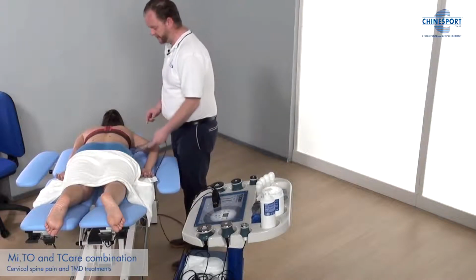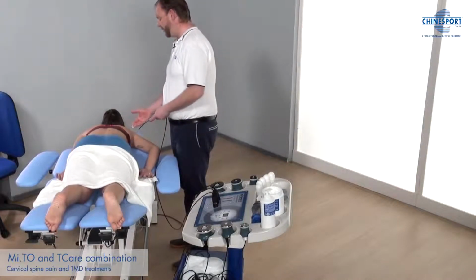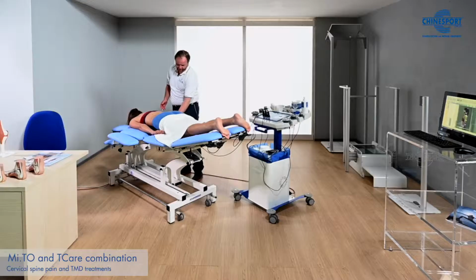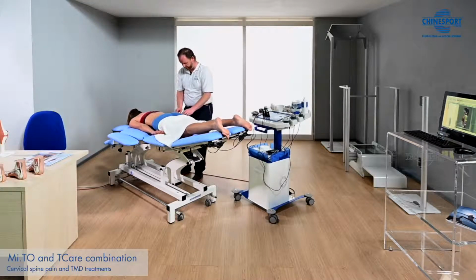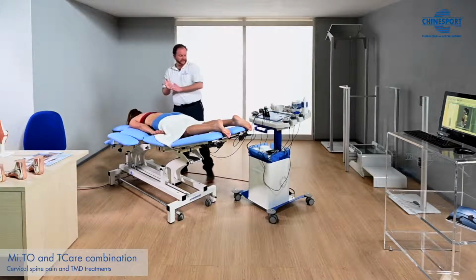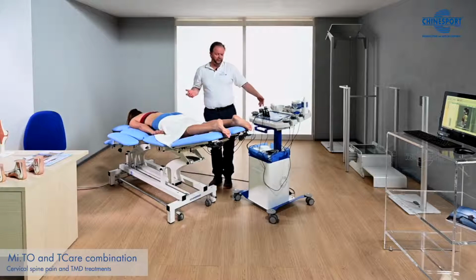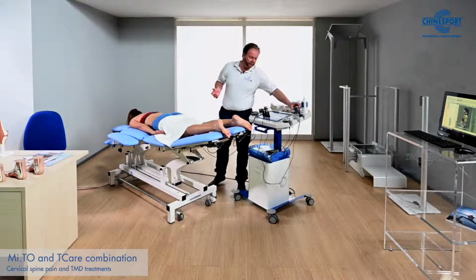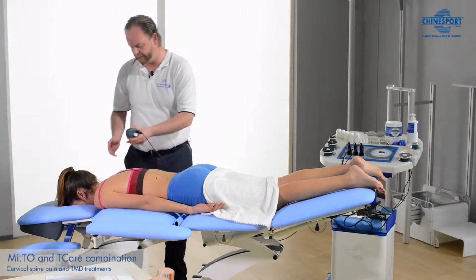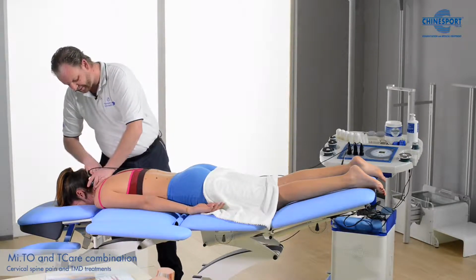So what we're going to do here when we have a problem with the neck area, then we can place either the passive plate under the belly, even under the chest. There is no contraindication for that, although I prefer to place it under the belly. It's more comfortable, particularly for the ladies.